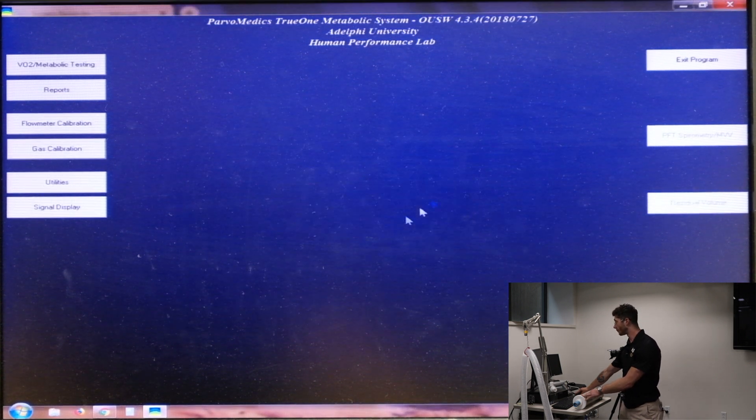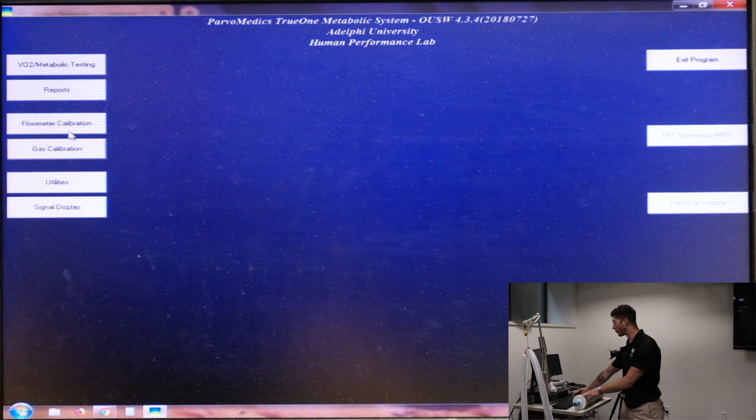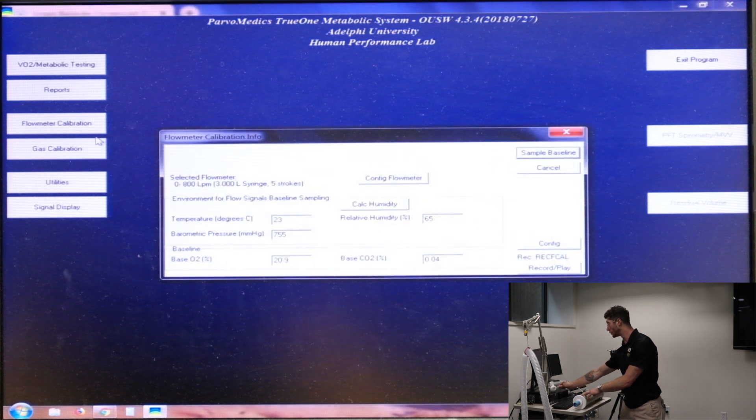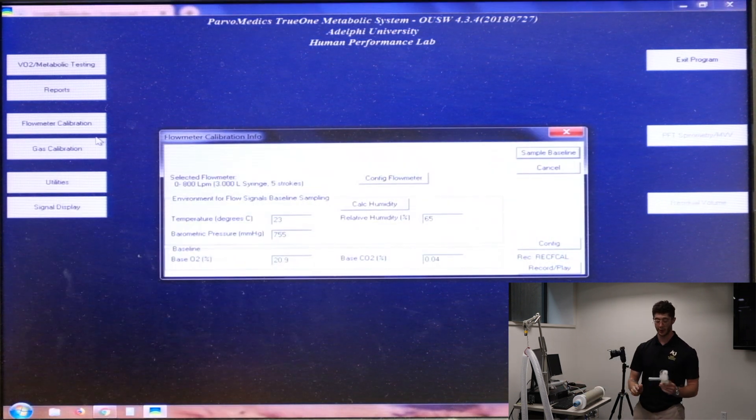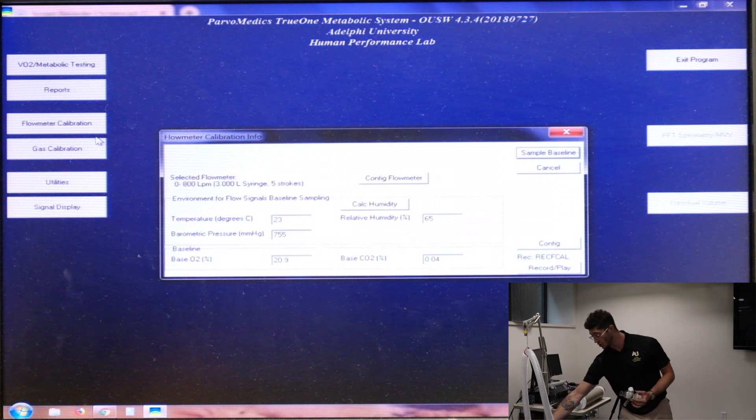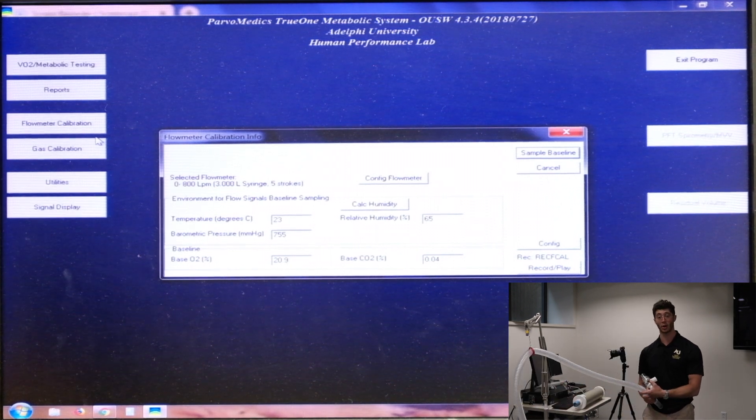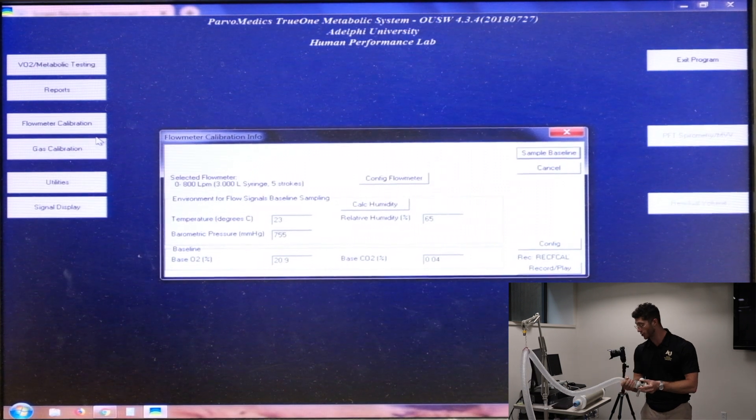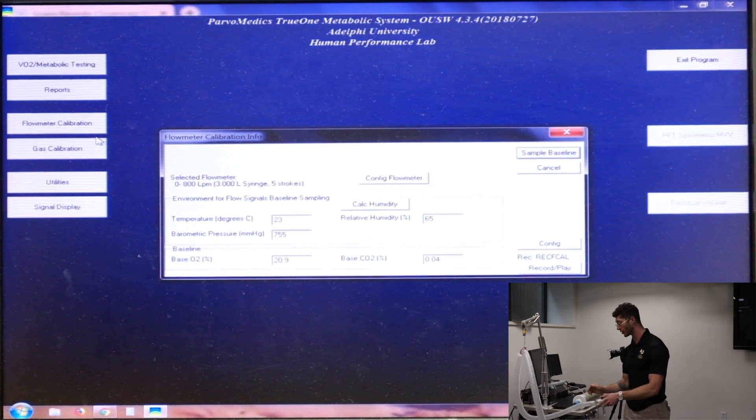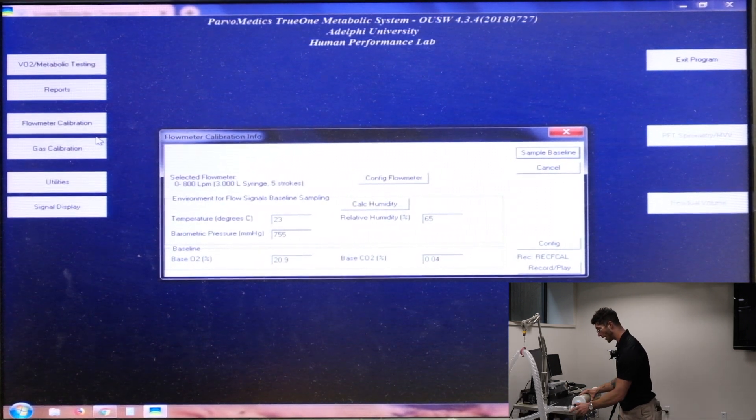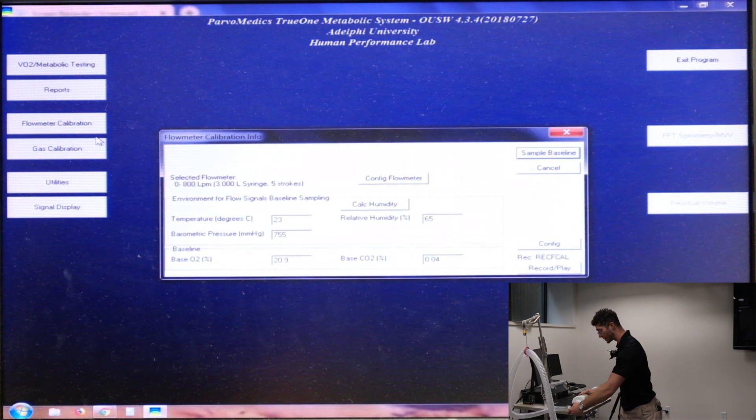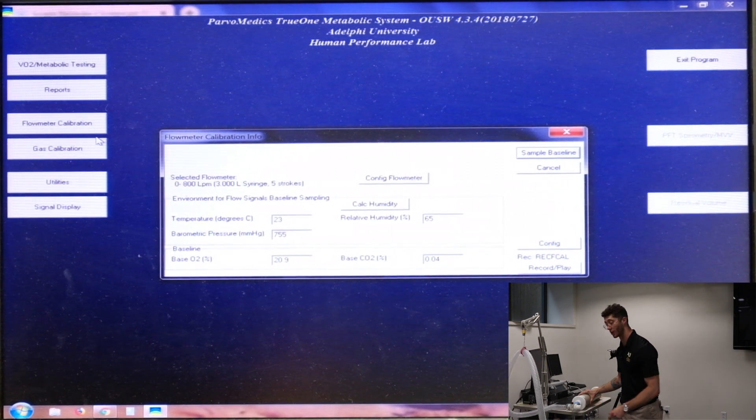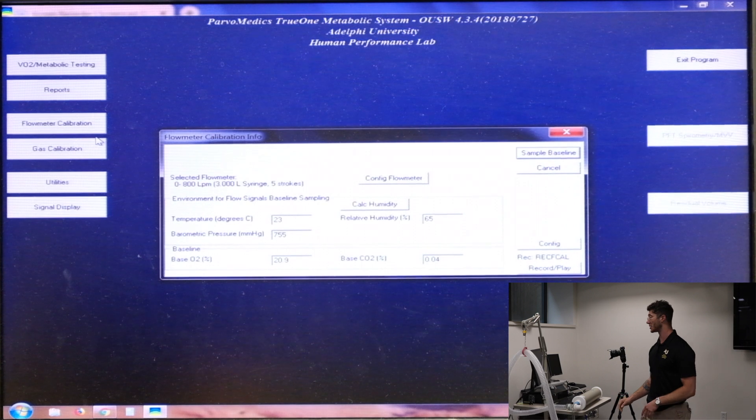So now we can click flow meter calibration. And before we go ahead and change anything, what we have to do is we have to attach our mouthpiece to the metabolic cart collection tube as well as to the three liter syringe. So you're attaching on the clear side, clear to clear, and the white mouthpiece adapter to the blue nozzle on the syringe. Now we're ready to get started.